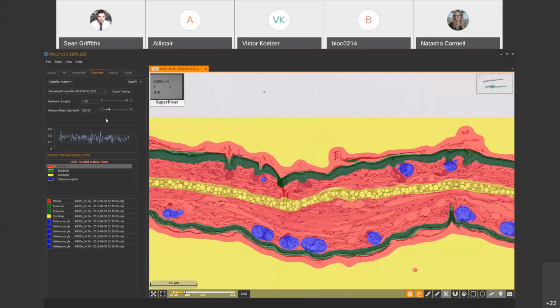So I get a few more questions. The next one is, some tumors that I work with, or even if you've got a large set of tumors, they've got a huge variation in appearance. For example, neuroblastoma can be a small round blue cell tumor in some areas, and it can be like mature nerve tissue in other areas in the same tumor, never mind across lots of different tumors. I've always found it difficult when trying to teach it because what you're calling tumor looks completely different in different parts of the slide. Does it handle that well, or is there a different way you can do it?